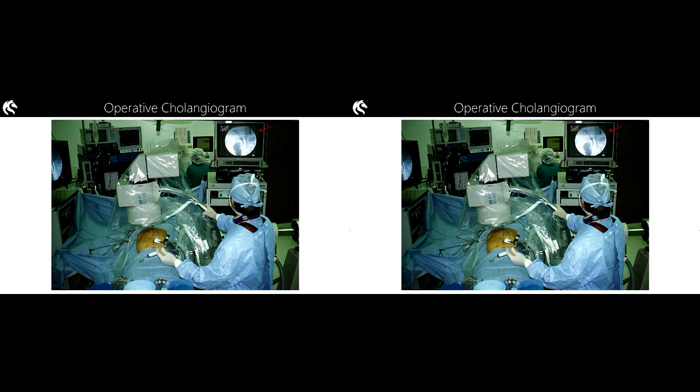The imaging procedure which the radiographer does is commonly referred to as an op chole, short for an operative cholangiogram. So on placement, you might well hear a phrasing similar to, we do an op chole as part of a lap chole. We do an operative cholangiogram as radiographers as part of the larger surgery of a laparoscopic cholecystectomy. We do an op chole as part of a lap chole.